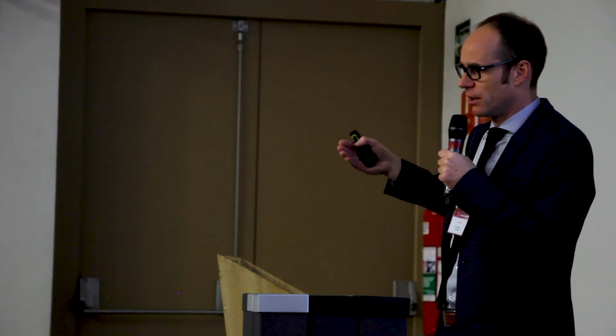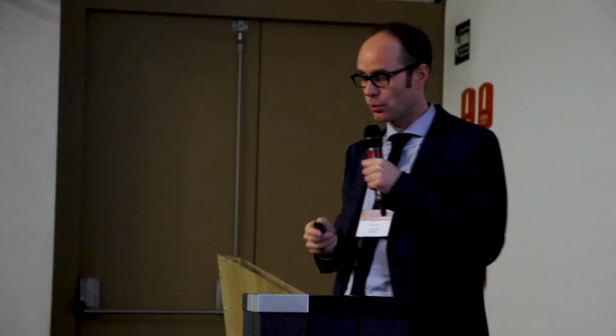And for this reason, we also could report different patterns in parallel. So if it's above a certain cutoff, we report it positive. And that's why we also are able to handle mixed patterns. So we don't have predefined mixed patterns. We are really looking for the patterns. So this is a negative list I mentioned. So here you see all the negatives.